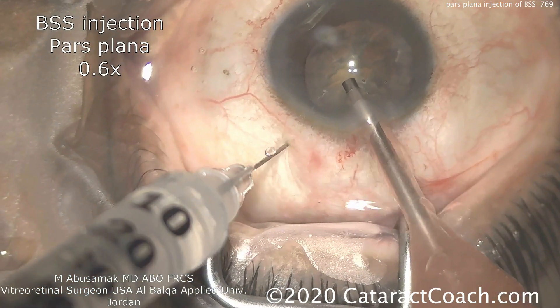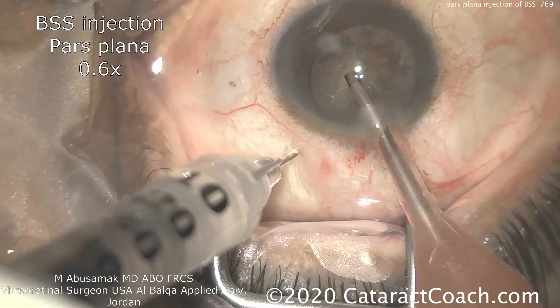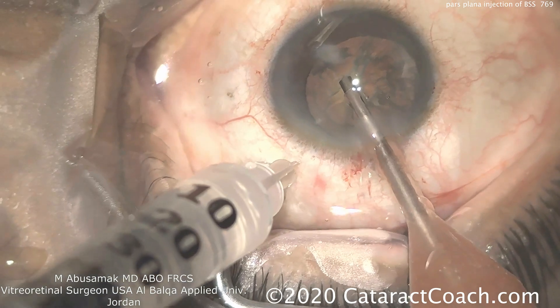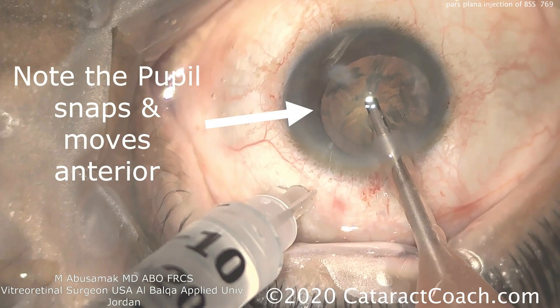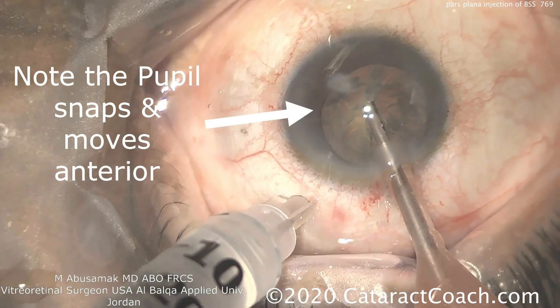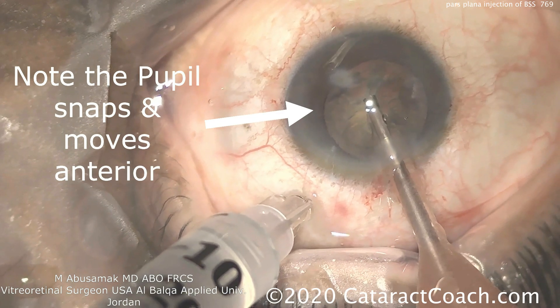To further support that lens, he's going to inject via the pars plana some balanced salt solution. Adding volume to the vitreous cavity is going to bring the lens more forward. Note the pupil snaps and moves anterior. Now he's got a more reasonable anterior chamber depth.